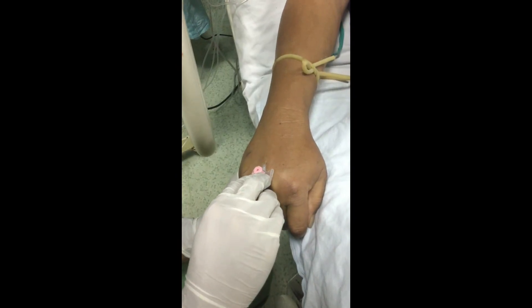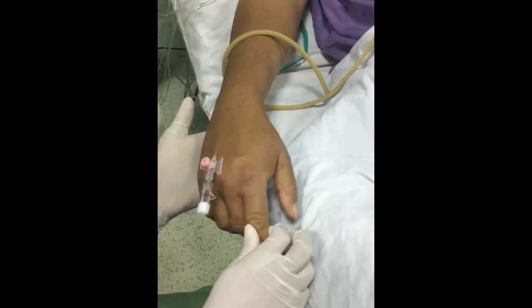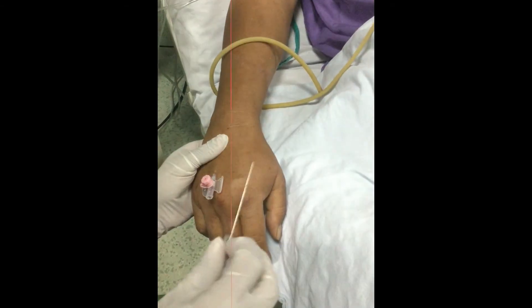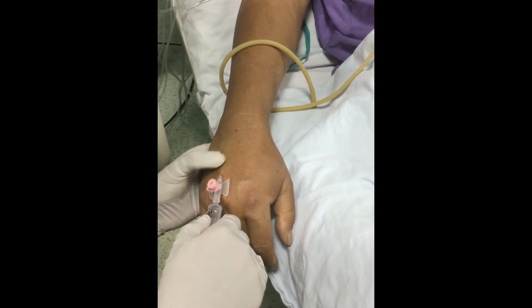Then advance only the catheter into the vein. Remove the tourniquet. Press at the end of the catheter, then remove the needle so that there won't be backflow of blood. Flush the cannula with normal saline.